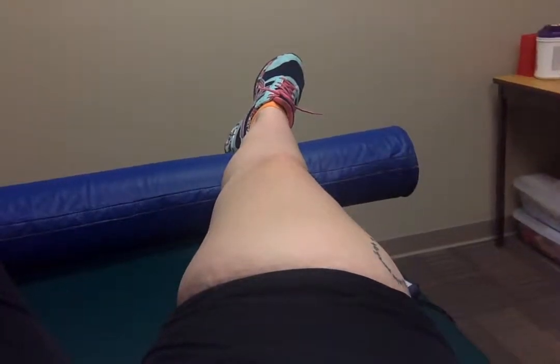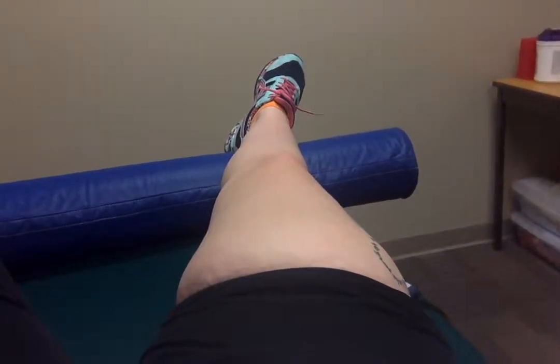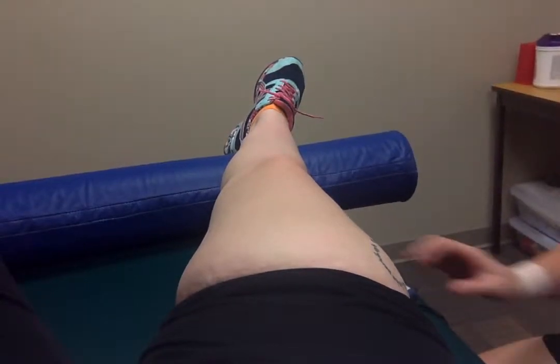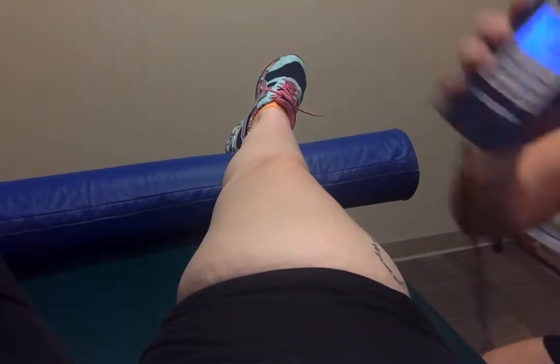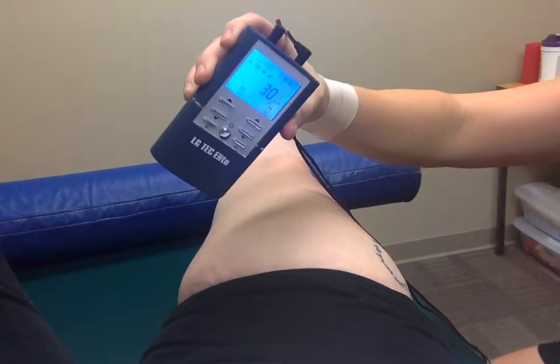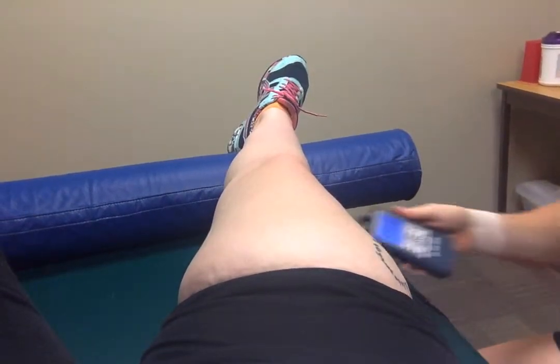One of the techniques we'd use for our ACL patient is neuromuscular re-ed with quad sets. They have a bunch of different machines here — the one we've got is a little home unit type of treatment.